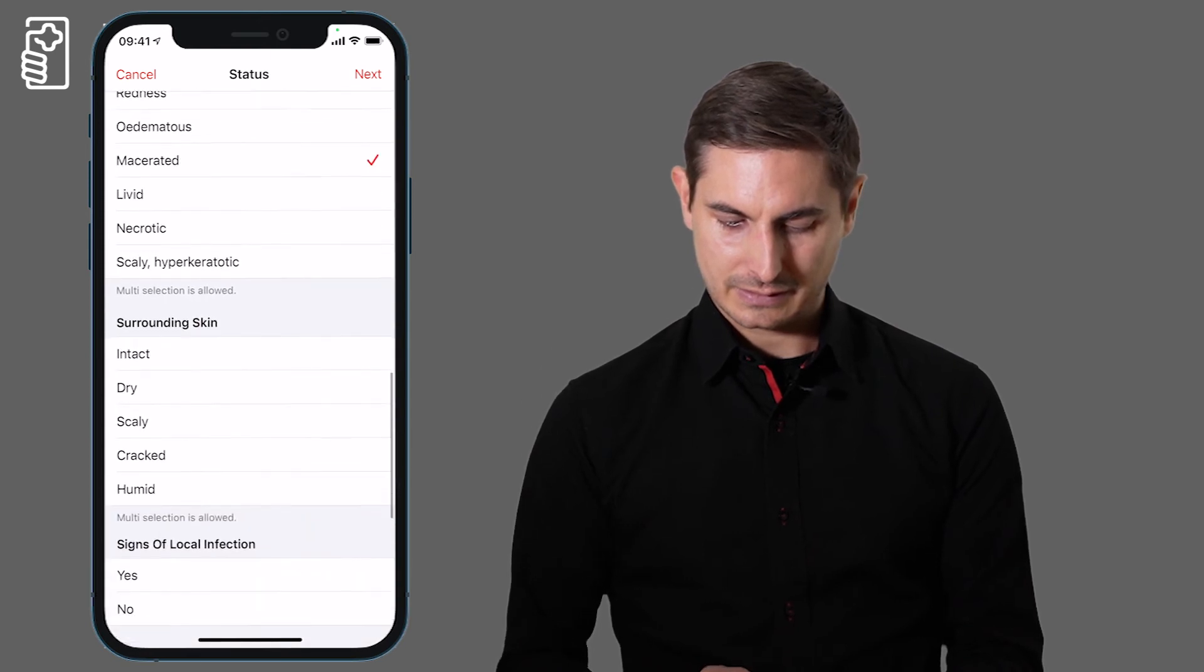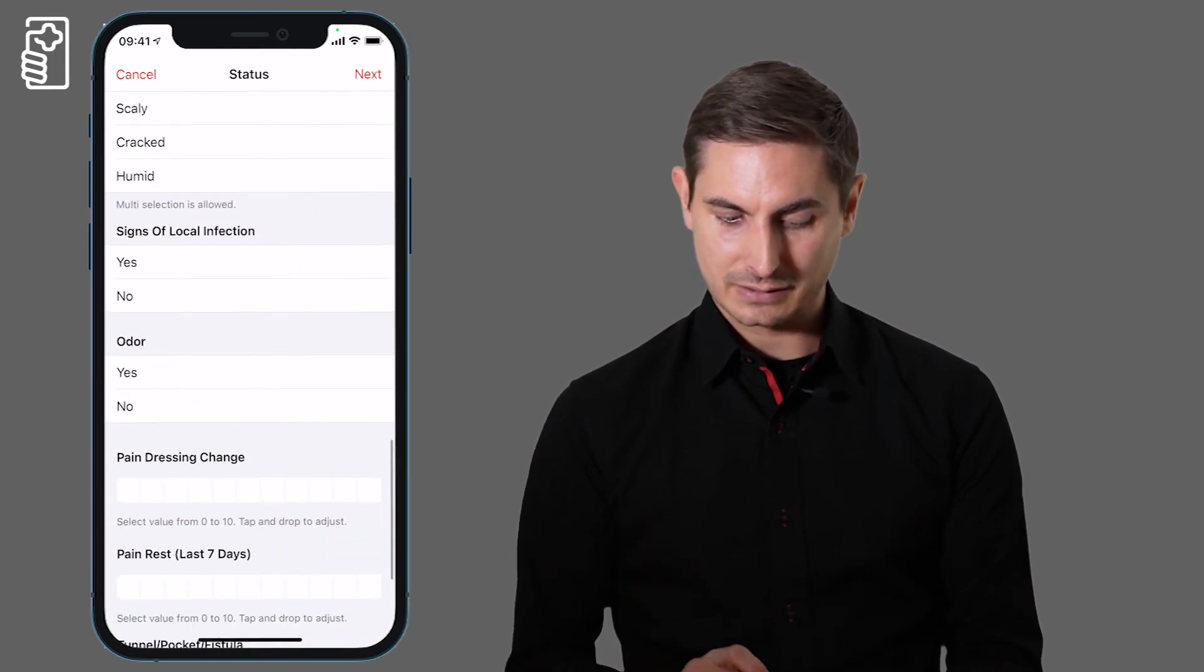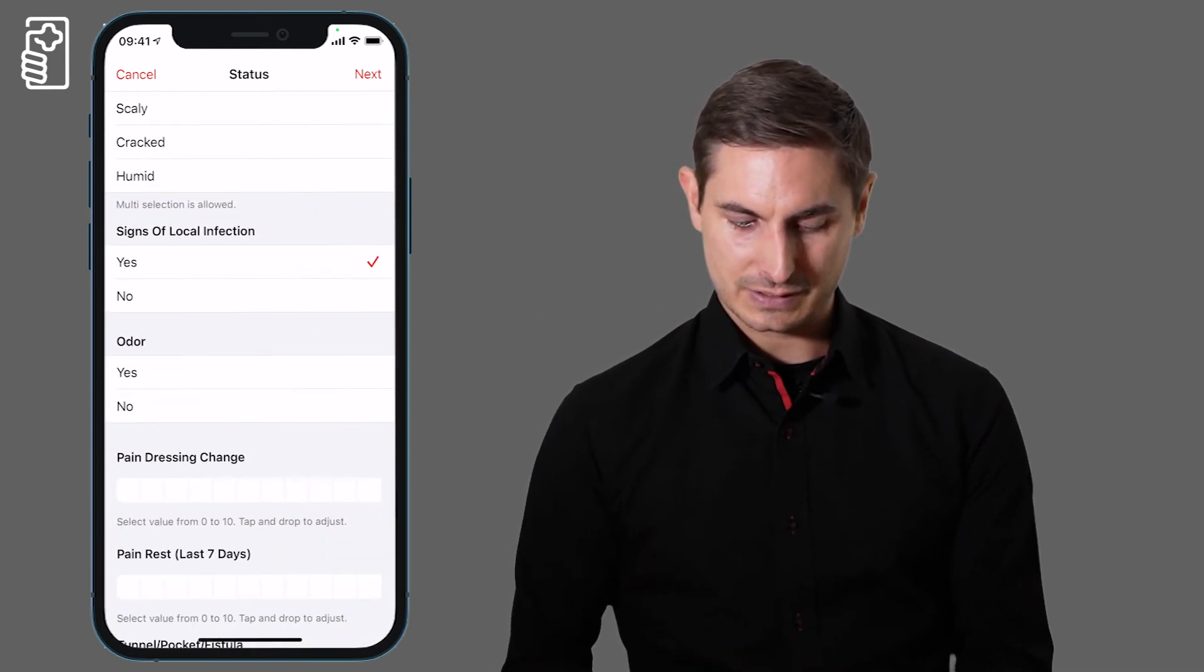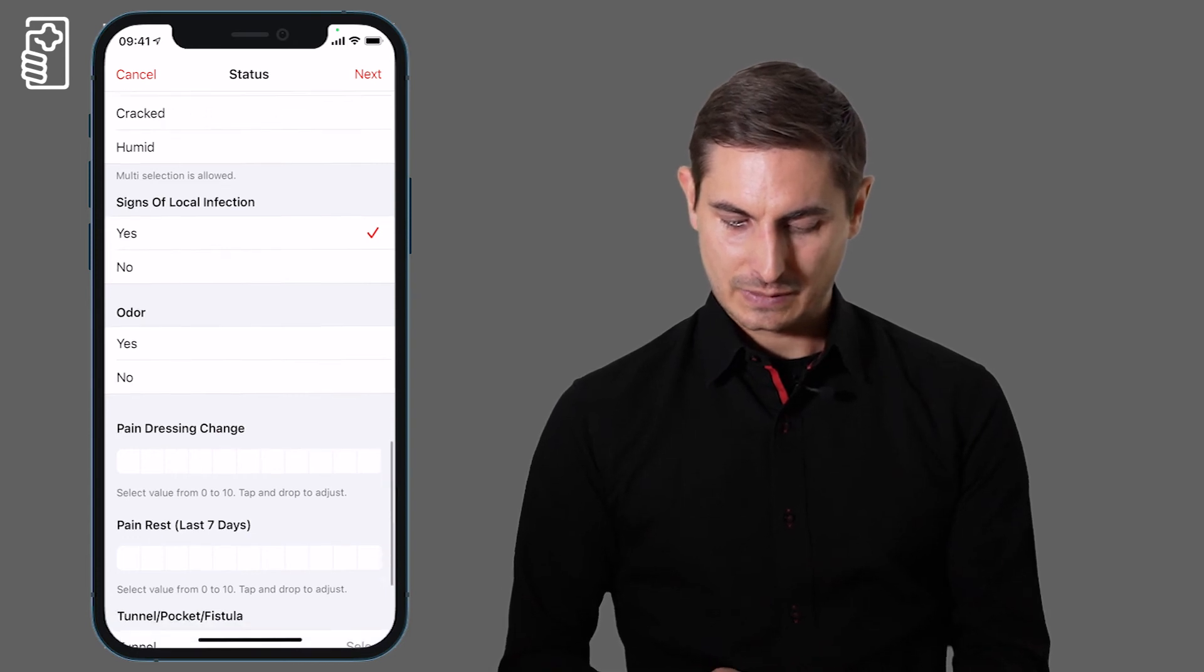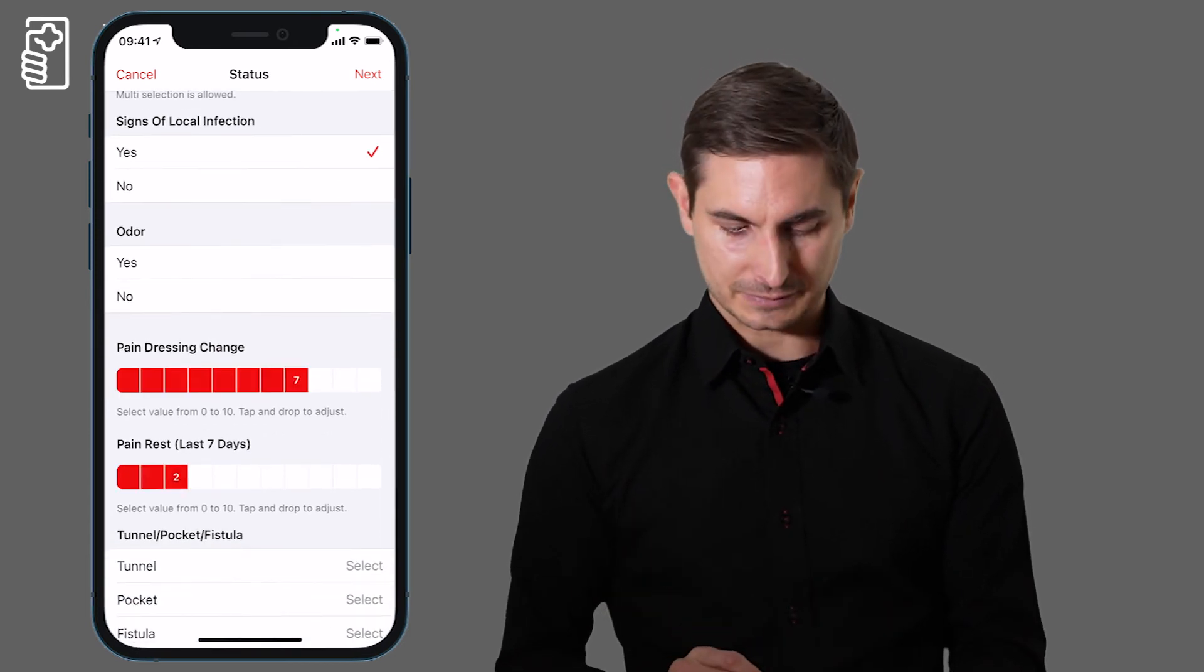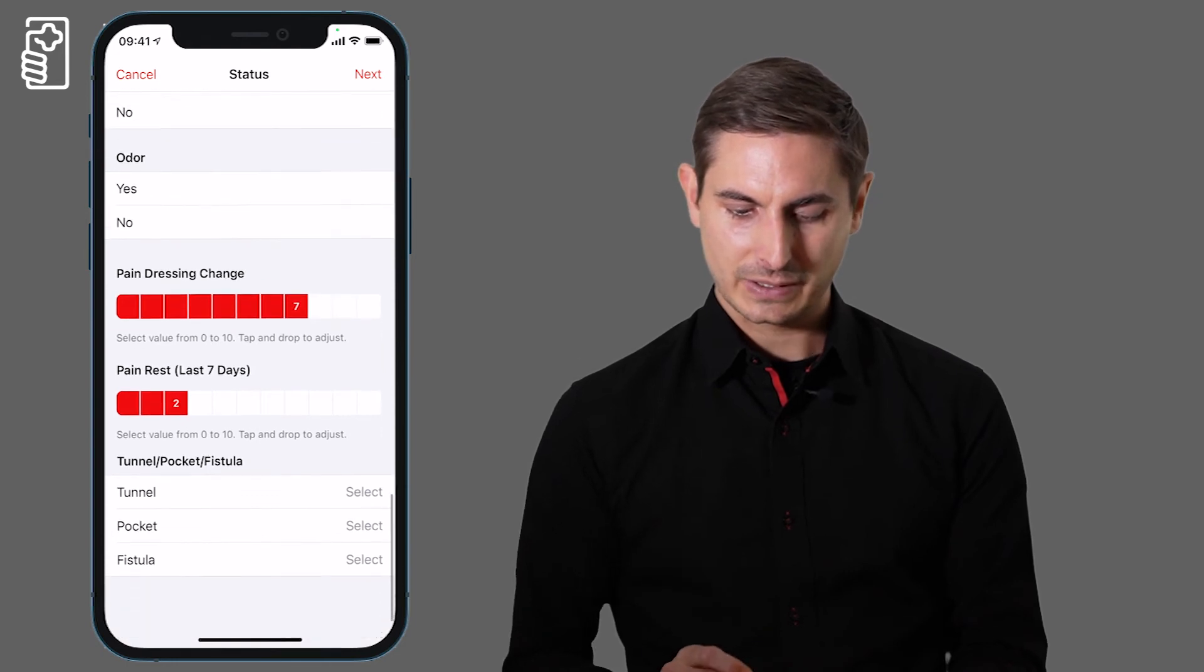Then the surrounding skin, signs of local infections, pain during the dressing change, pain at rest.